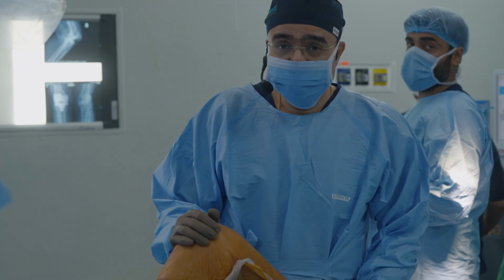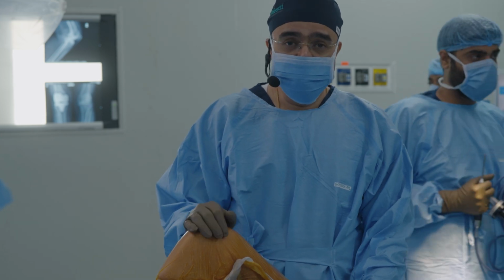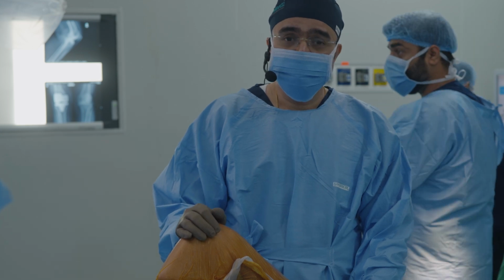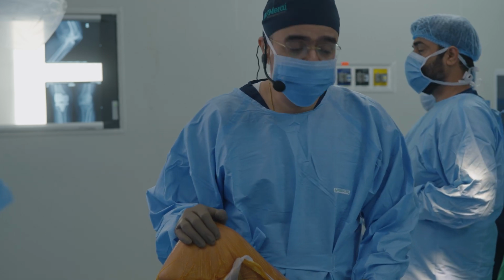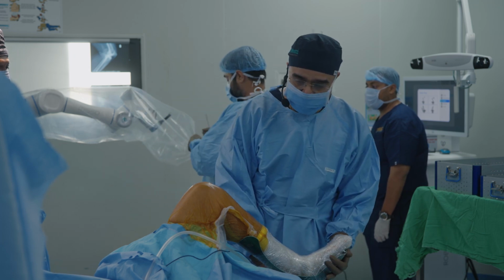Hello, so we'll be operating on a 65-year-old lady with knee osteoarthritis for a left total knee replacement using the Misso Robot. As you can see, the robot preparation is going on in the background. While the robot calibration is going on, I'd like to show you some knee movements.